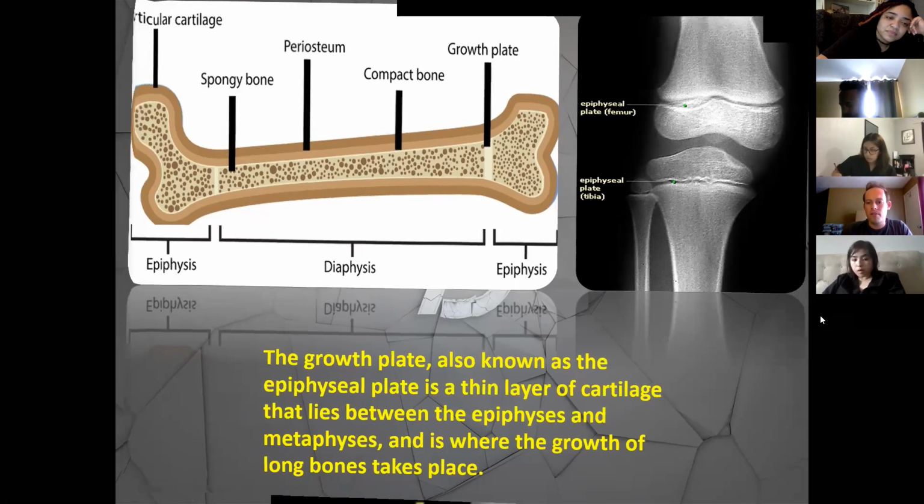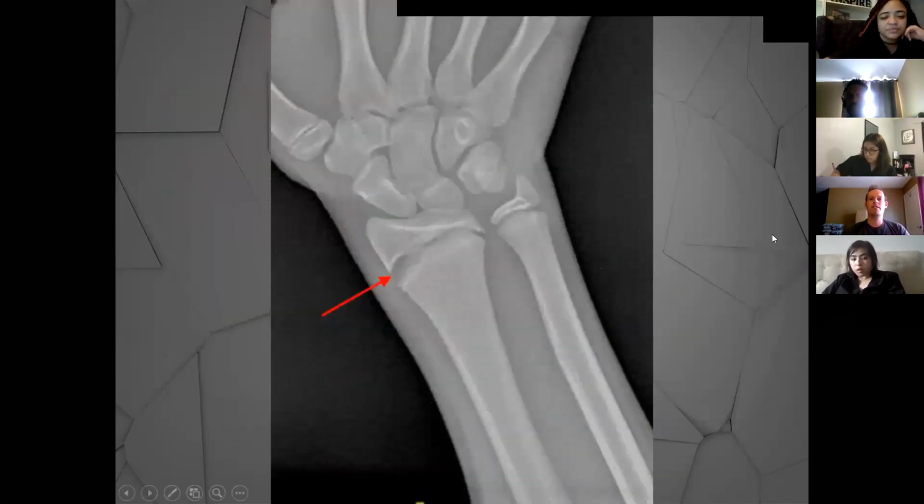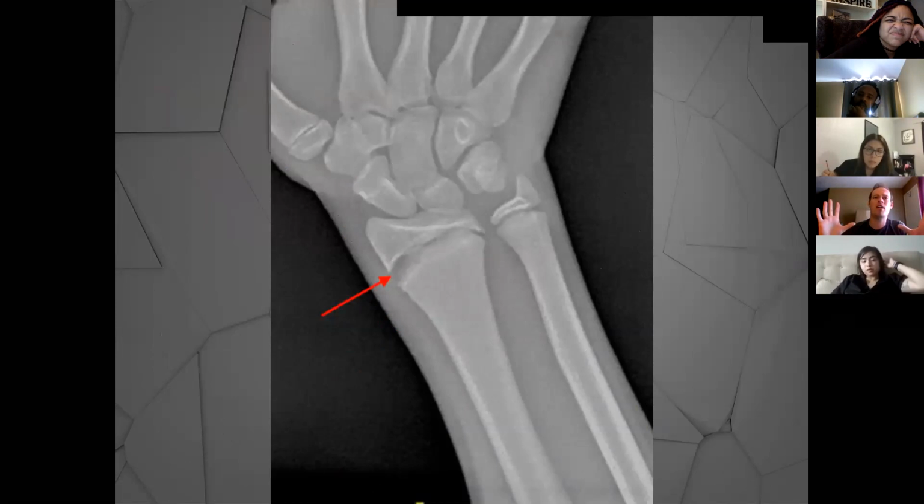So when we're looking at these growth plates, guys, I want you to develop an eye for this. Did anyone see this on an x-ray yesterday? Did anybody do a young patient that had epiphyseal plates? If you have not yet, you will. One thing I don't want you to do is an x-ray of a wrist like this. Actually, it's a very poorly done wrist, because it's crooked on the film and they got too much of the forearm included. Don't do your wrist x-ray like this.